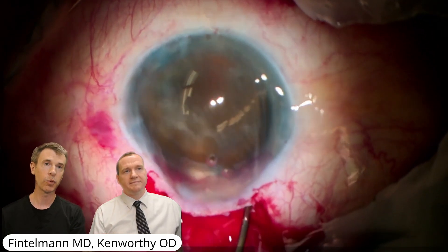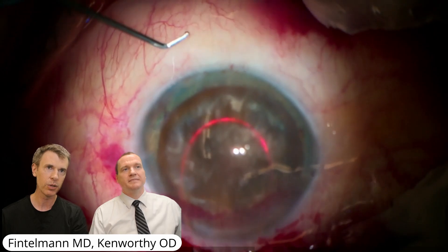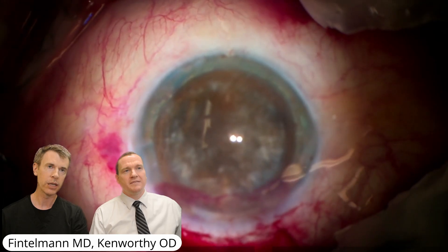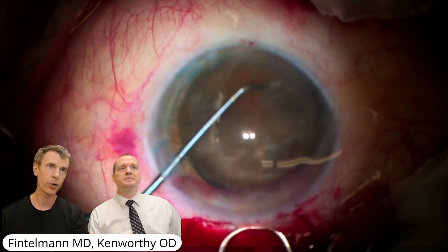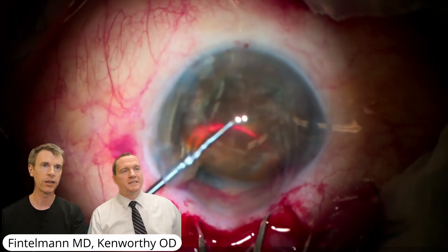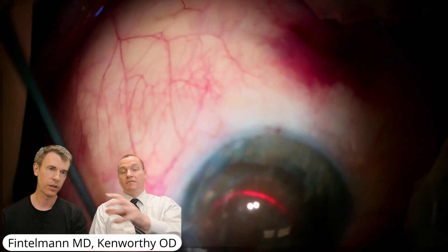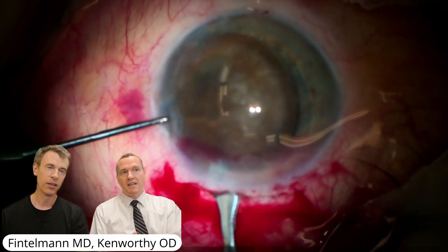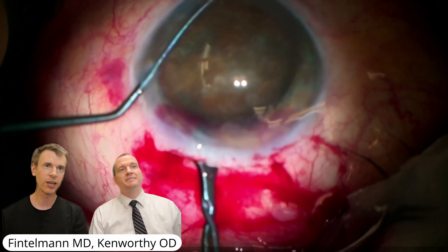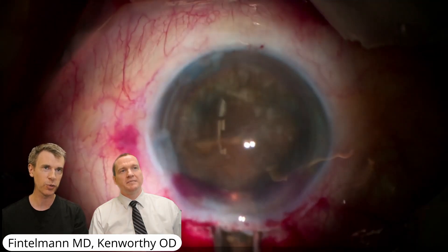Trying to get the lens out in one piece. You can see that dark brunescent reflex — barely can see it through. At this point I have trouble getting it out because the lens is still too big. To try and get it out without enlarging the wound too much, I first try to move it with two instruments and that doesn't work. At some point I tried to cut it in half. That is a huge dense lens. At what point did you decide this needed to be manual small incision rather than phaco? I tried phaco, the rhexis was small, and then the lens started to dive posteriorly. At that point I said nope, this is not going to work. I need a different approach. I tried splitting it with my cataract surgery tools but it was too dense.